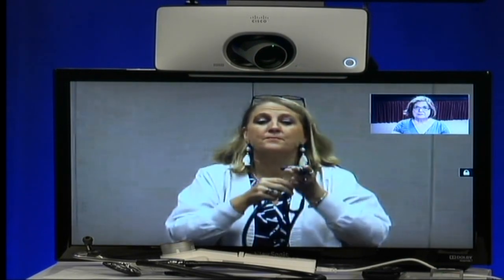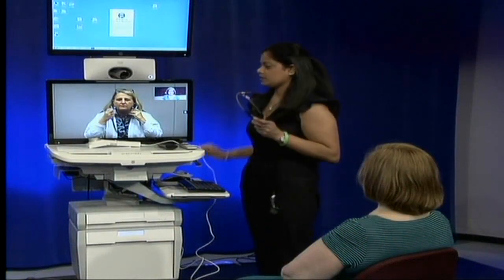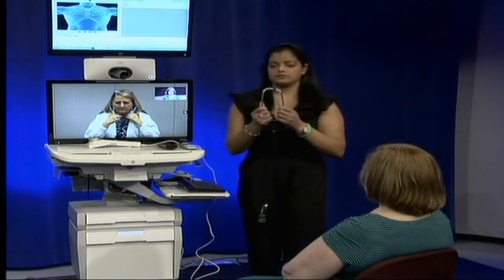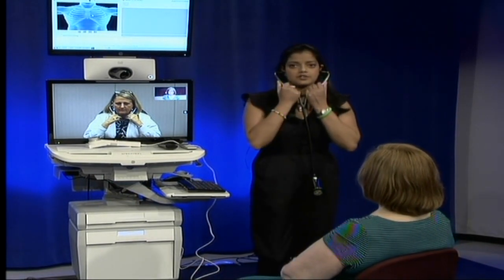Okay, we have the stethoscope application open and the stethoscope on. So Dr. Wilson has instructed me to listen to the breath sounds.